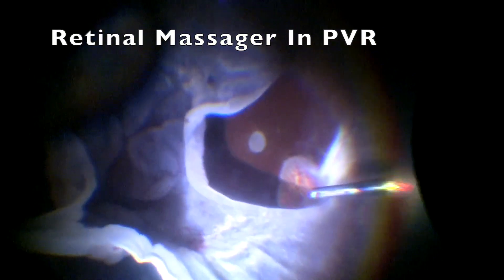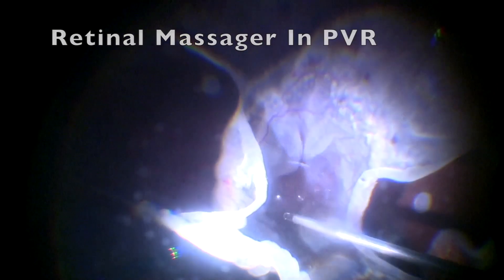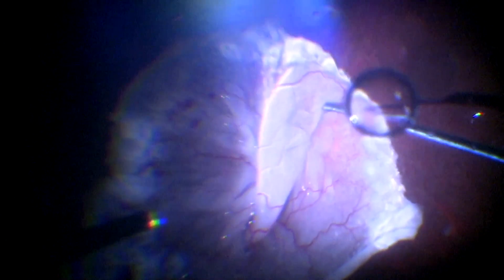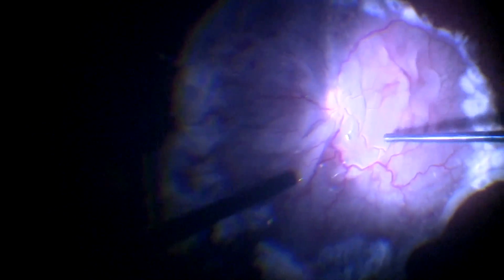Another indication where the retinal massager has been used is in cases of severe PVR with stiff retinal folds. After doing a vitrectomy and retinectomy, the massager is used to atraumatically iron out the stiff retinal folds and flatten the retina. 360-degree laser is then done to the retinectomy margins.